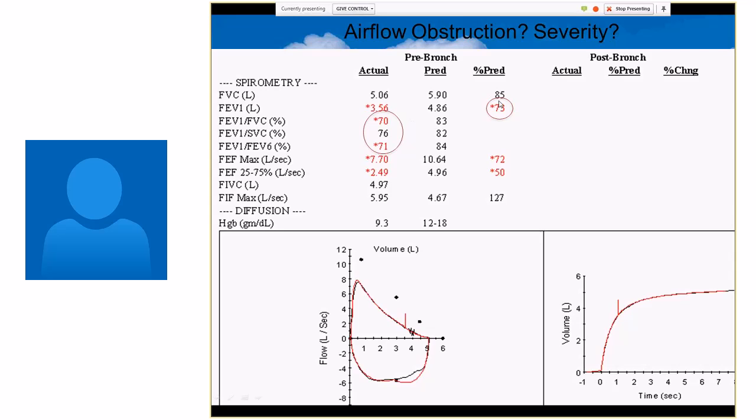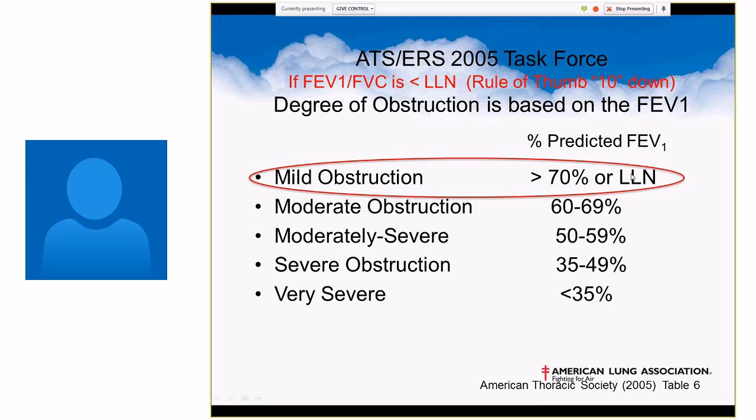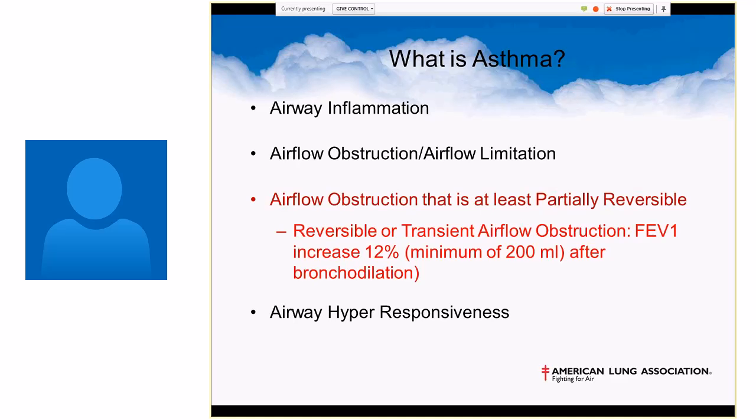My computers are sophisticated enough to highlight things below the lower limits of normal. It's highlighted in red with a little asterisk next to it. We already determined it was a good blow. We had good volume time curve and a good flow volume loop. Once we determine if the patient has airflow obstruction, then we need to decide what is severity. Severity is always related to the FEV1 in all diseases that we talk about. In this case, the FEV1 is 73%. The ratio determines if a patient has obstruction. The FEV1 determines the severity of said obstruction. According to this scale, the patient has a mild airflow obstruction.